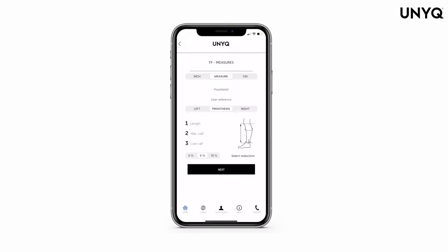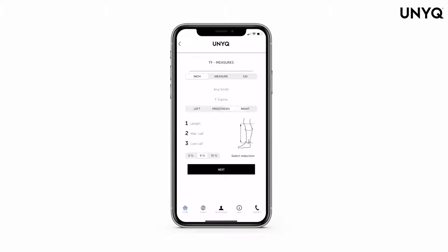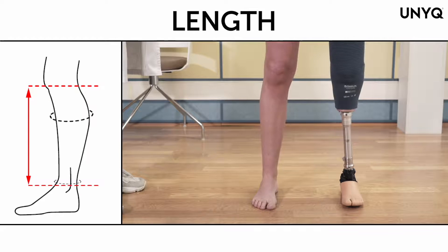Select if you would prefer to measure in inches or in centimeters. Introduce the name of the prosthetist and your patient's name or ID number as a user reference. Choose whether the prosthesis is on the left or the right leg.